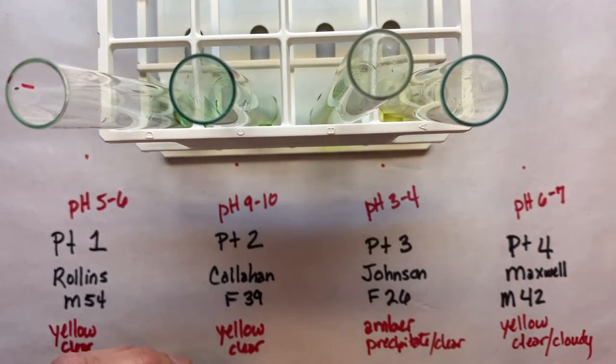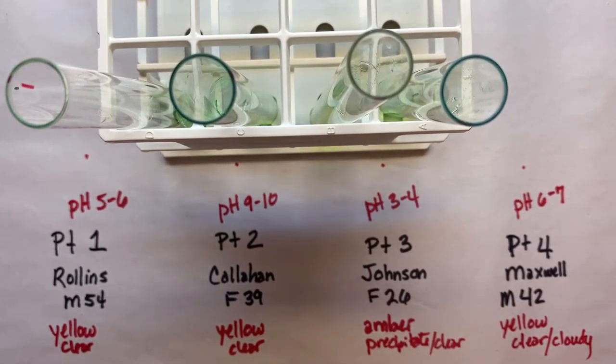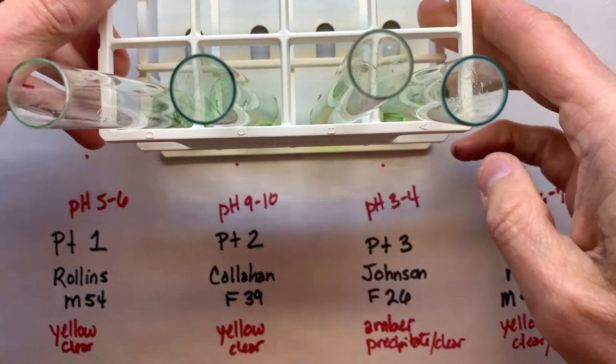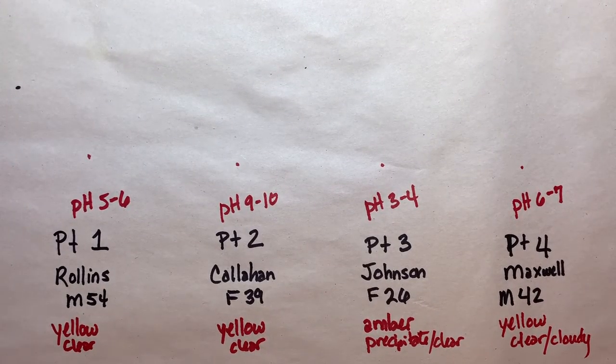All right, and the last one, patient number four. Okay, so that gives us 10 drops of Benedict's solution into one milliliter of urine for each of these patients. And now let's look at these tubes and record the colors that we see.